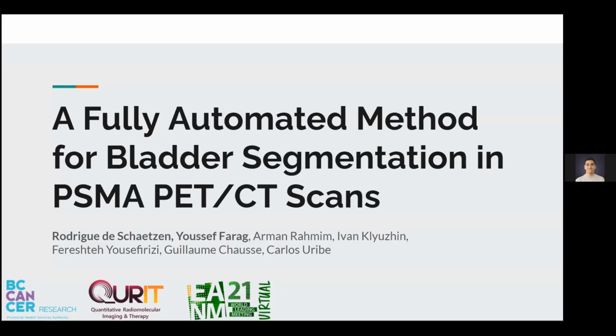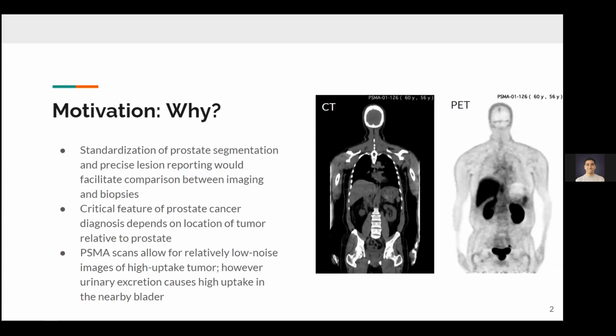Hello, everyone. Today, we're going to be presenting on our EANM accepted abstract titled A Fully Automated Method for Bladder Segmentation in PSMA PET CT Scans. Our project's focus is on improving the clinical workflow for prostate cancer diagnostics.